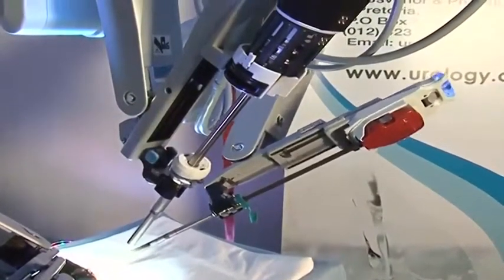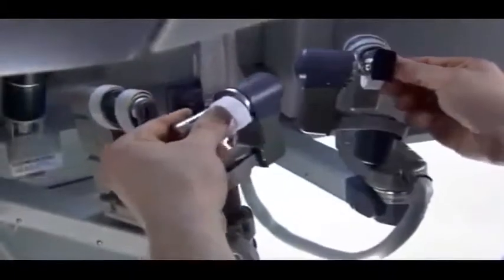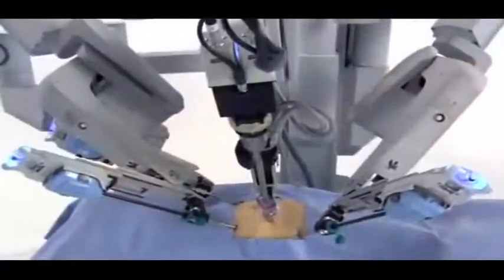The time of the surgery is more or less the same and may even be a little longer than what we're doing with open surgery at the moment. But certainly the morbidity to the patient in terms of blood loss and the dangerous aspects of big cancer surgery are far easier to control. And that's where the patients really will benefit. And the recovery, of course. The recovery is less than half of the time, yeah.